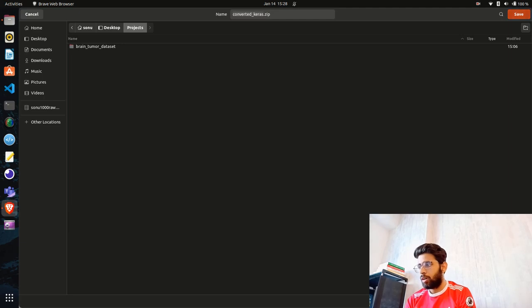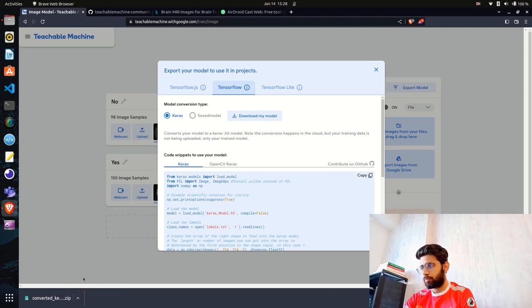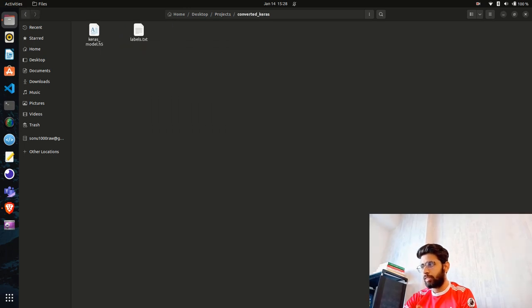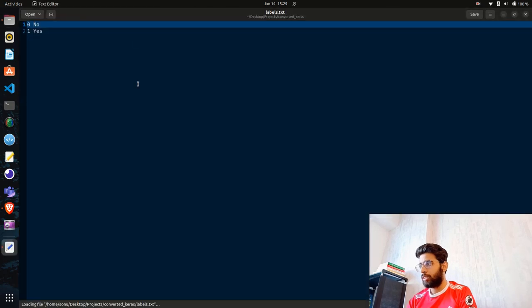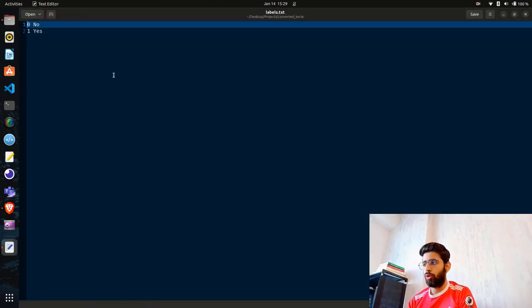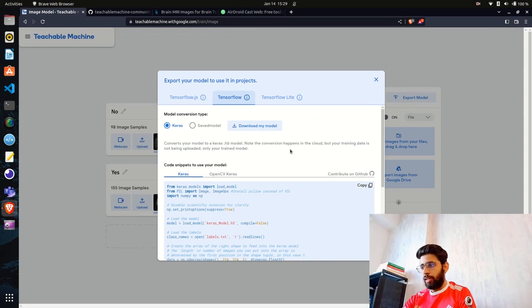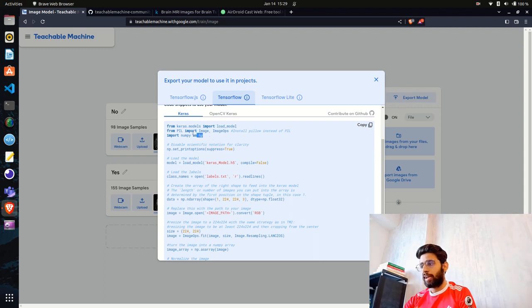It's converting and downloading the model. I'll move it to my projects folder and extract the zip. Inside you can see two files: 'labels.txt' containing the two class labels — index 0 for 'No' and index 1 for 'Yes' — and the model in H5 format, which is how TensorFlow/Keras models are saved. Teachable Machine also provides a code snippet to use the model.